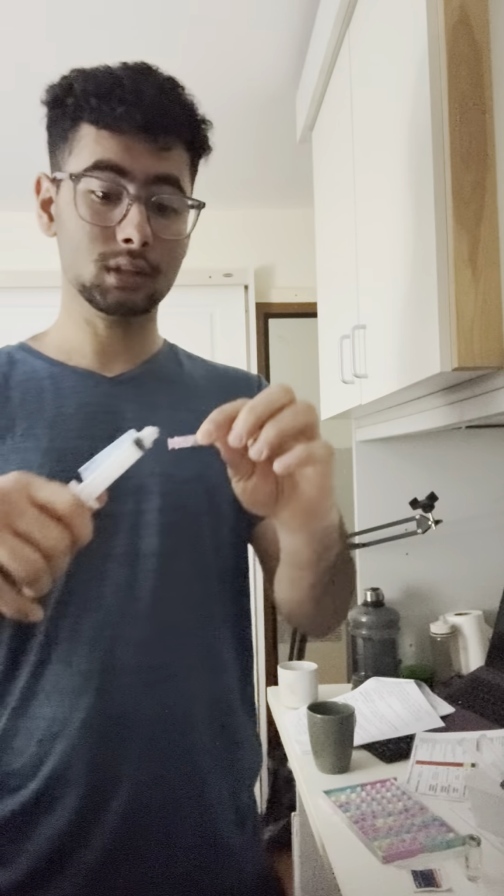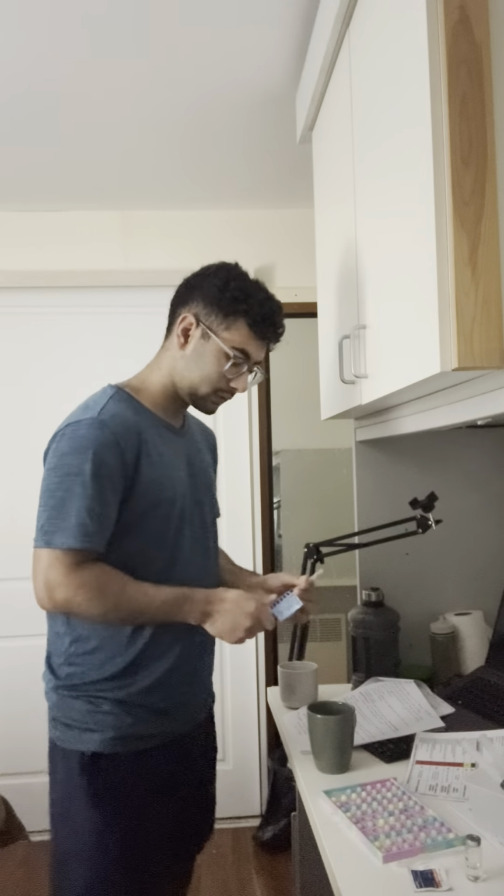So what I did was I need to draw up the water, right? I have a drawing up needle, so that means I need 3 draw up needles, right? I'm going to take it like this, and I'm going to draw. This is the water as well. So everything is from here because I don't have the required equipment that is needed, right?